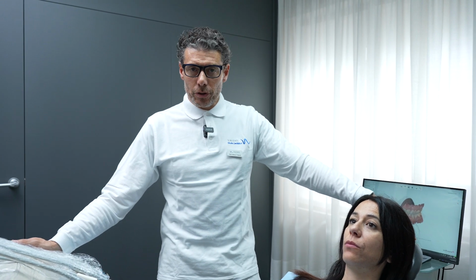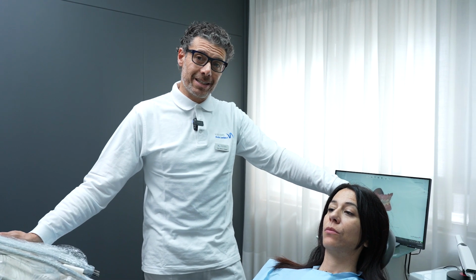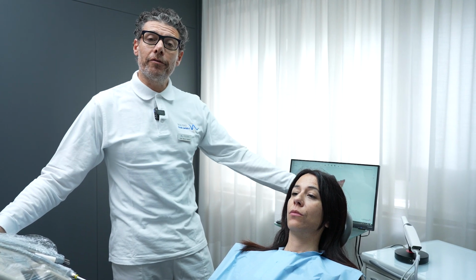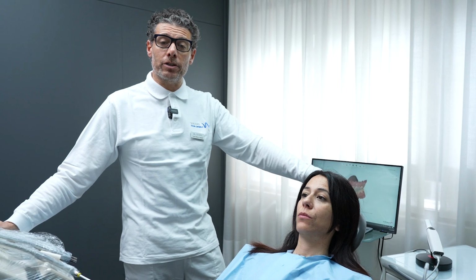After taking the patient's intraoral scans, we scan static occlusion and dynamic occlusion, and then we send the files to our dental technician through the 3-shape Communicate software.